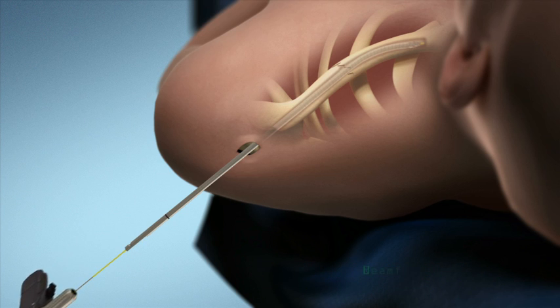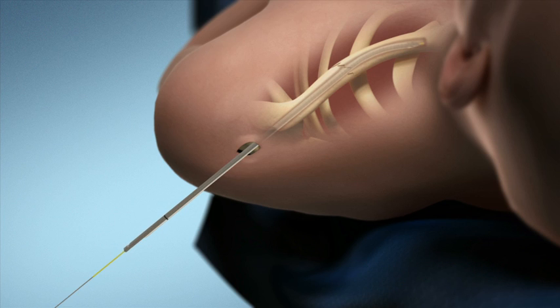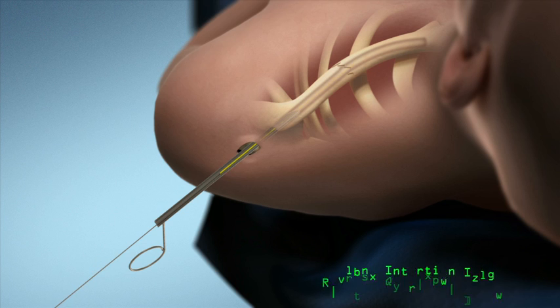Detach the power and advance the reamer depth gauge over the reamer to measure the necessary implant length as indicated by the mark on the reamer shaft. Remove the reamer while retaining the guide wire. Advance the implant insertion guide over the guide wire and into the lateral fragment. Remove the guide wire and inner guide handle, retaining the guide channel.